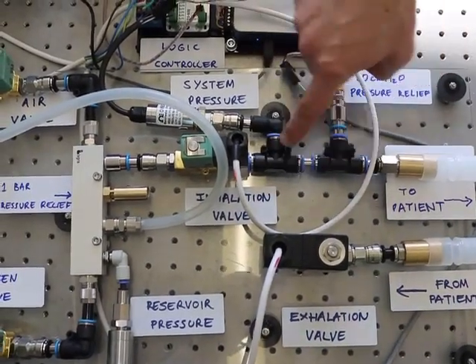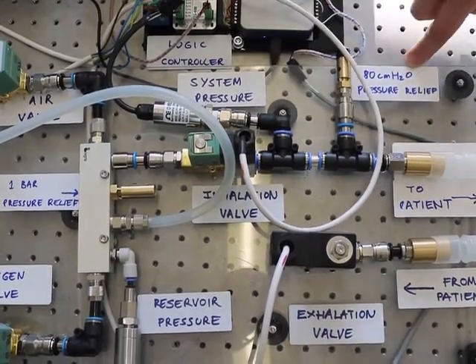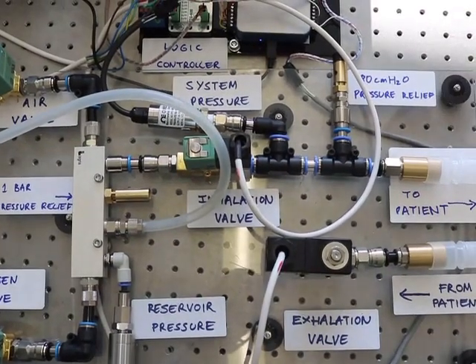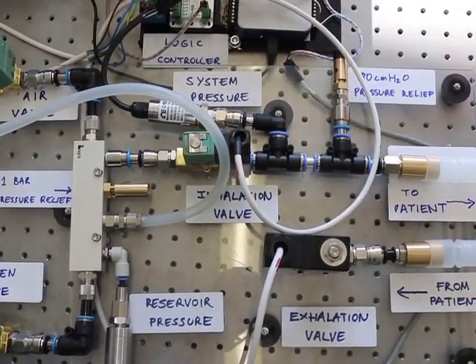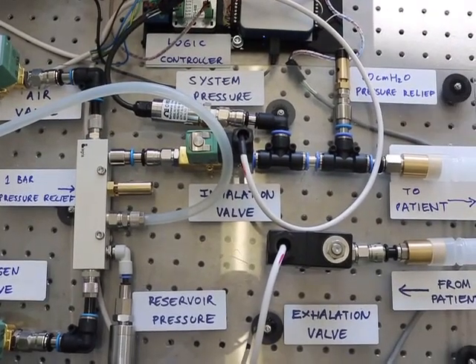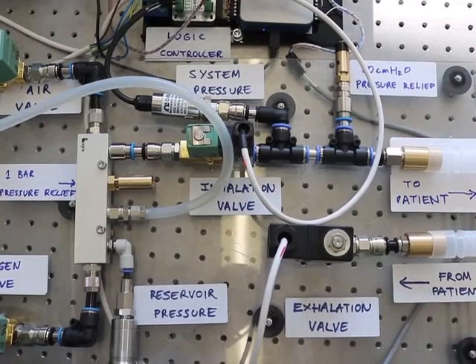So just downstream of where this second pressure sensor is, we have another pressure relief valve. This one's a lower pressure, it's 80 centimeters of water. So that protects the patient in case anything goes wrong and the pressure goes too high here, there's no way it can exceed this number. And that will protect harm from the patient. We then have this connector that goes off via the ventilation tubing to the patient.